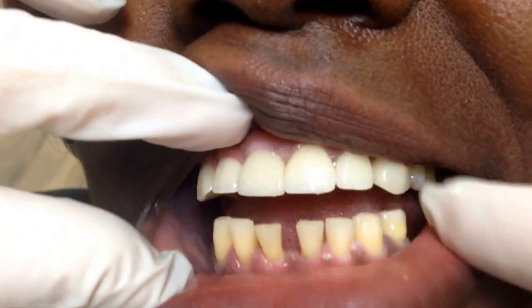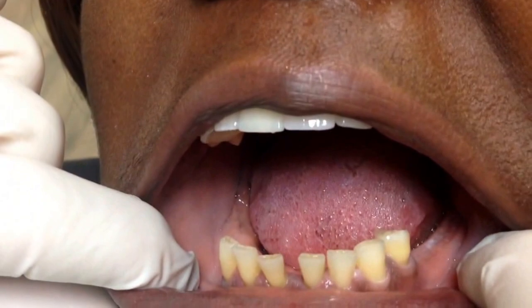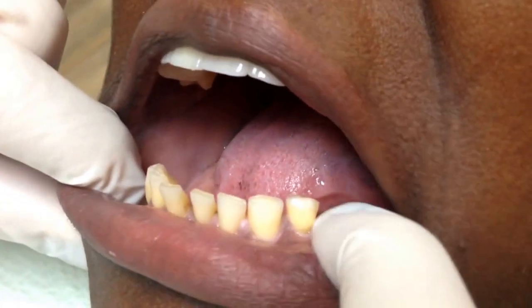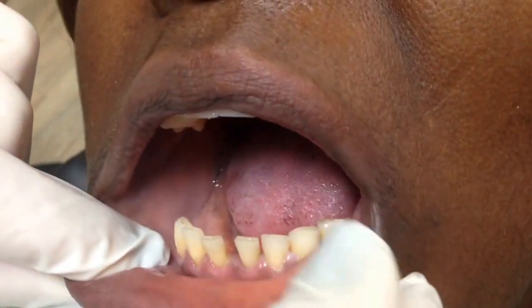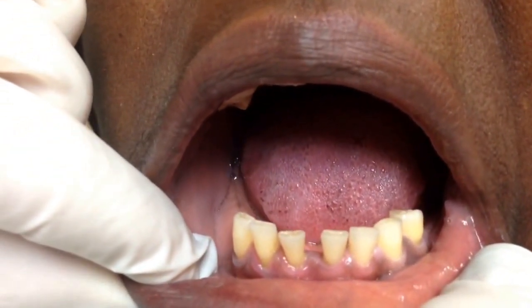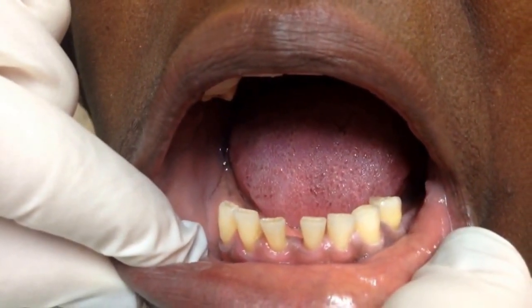So on a situation like this, go ahead and open big. Where she doesn't have all her teeth on the lower, we can actually go about two to three teeth back on this side, and we can probably go about two teeth back on the right side. So she can basically have a full arch of lower teeth. And believe it or not, we're going to close the gaps. So let's go ahead and look at the appliance.